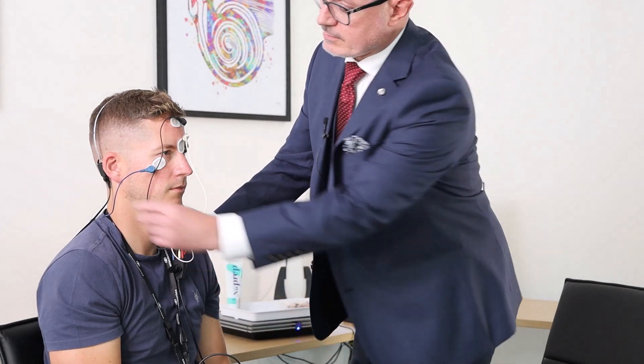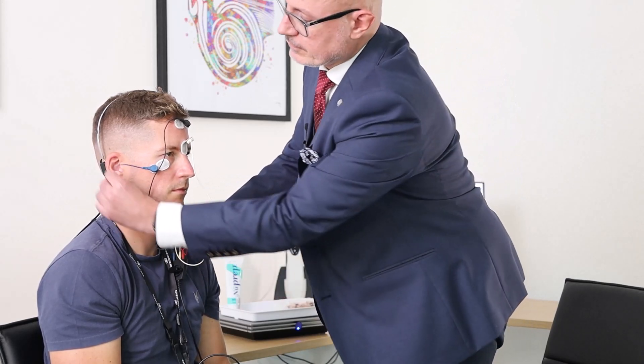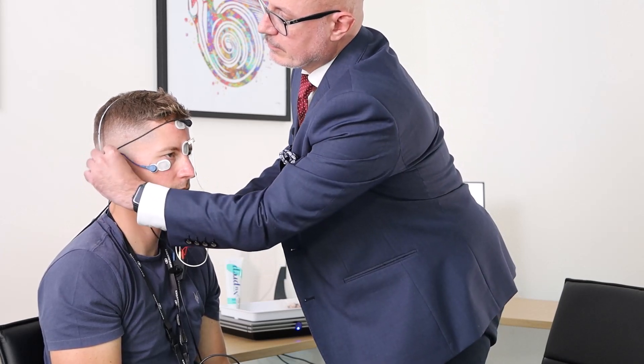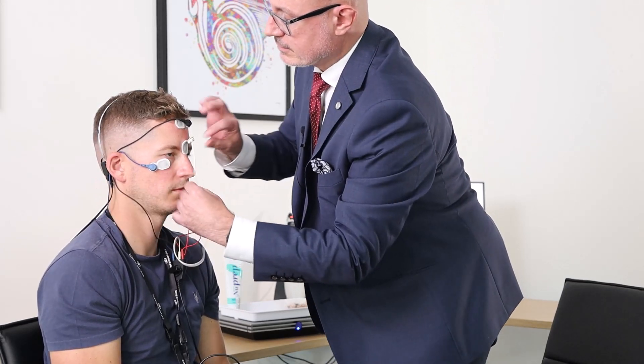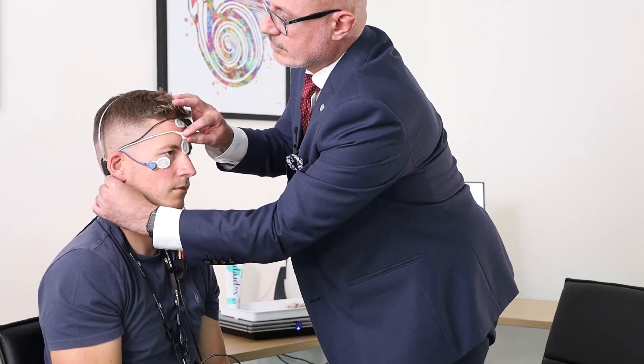One final tip and trick that can sometimes catch us out in clinic. In this BC VEMP measurement, we have removed a lot of the electrodes from behind the ear, whereas previously we had those tidied away whilst using inserts. The reason for that is that sometimes when we have these situated right near the BC transducer, we can pick up a little bit of artefact just from the stimulus.